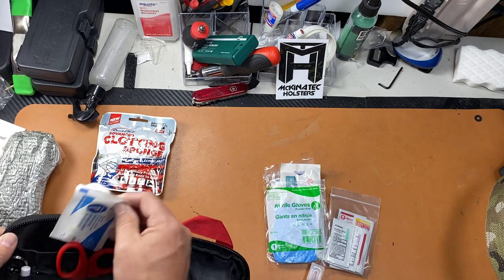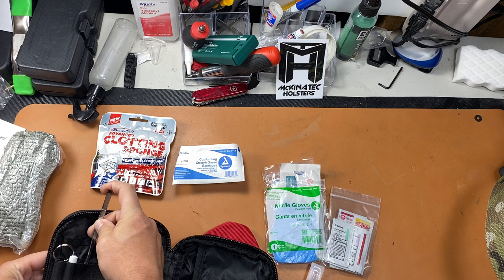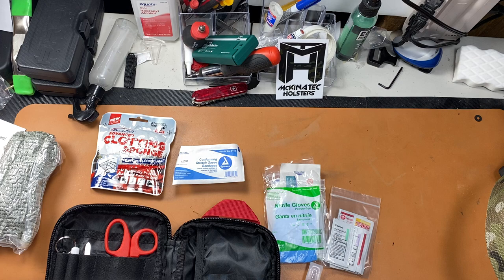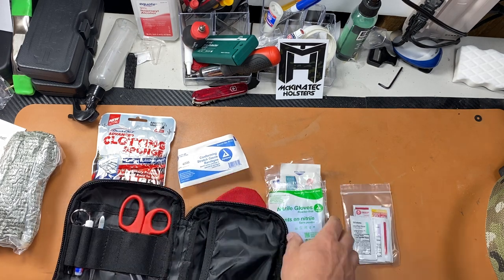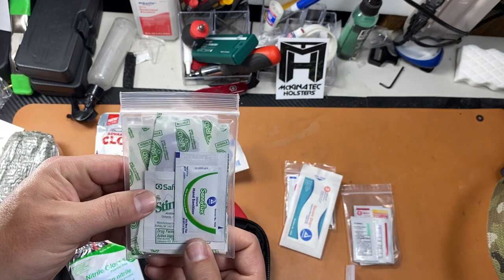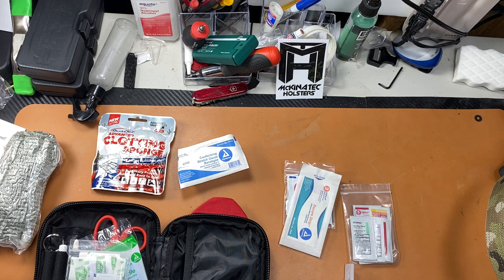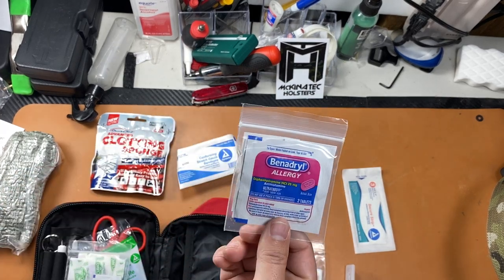There's tons of space inside and it's nicely laid out — high quality pouch. The pouch is made in China but everything else is US-based. You get nitrile gloves and a package of hand sanitizer, which is like gold right now.